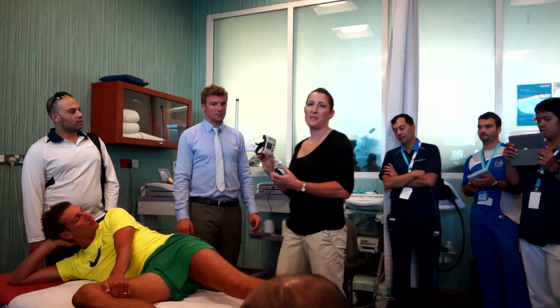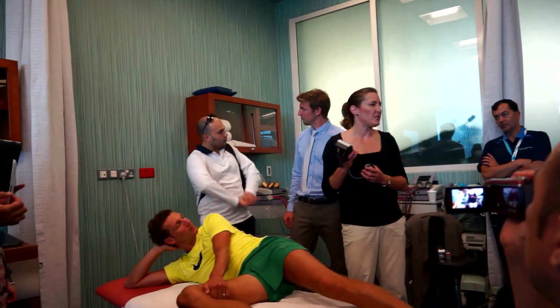Just to give you an example, his first one was 136 and the second one was 165. So it can vary quite considerably, and that's why it's important to take the maximum rather than the average of the measures. It has been described in other tests to take the average, but we as a research group feel we want their maximum, and just because maybe one time they switched off and did a poor measure, we don't want that to influence their maximum result. We want to know what's the best that they can produce with this test.